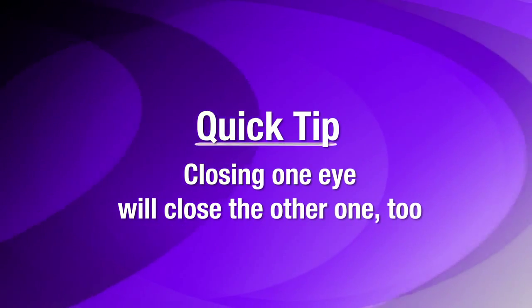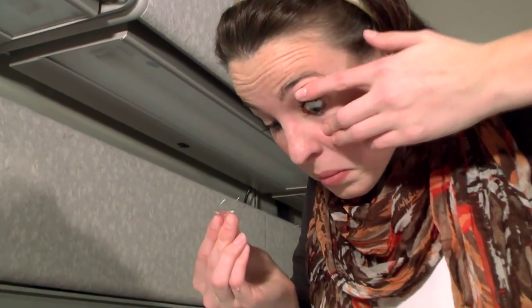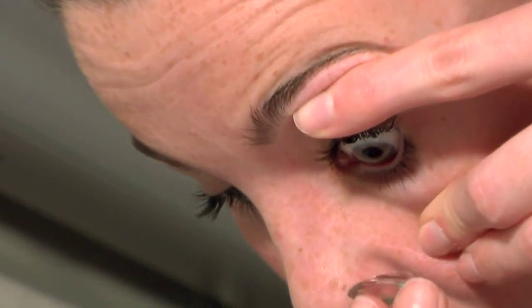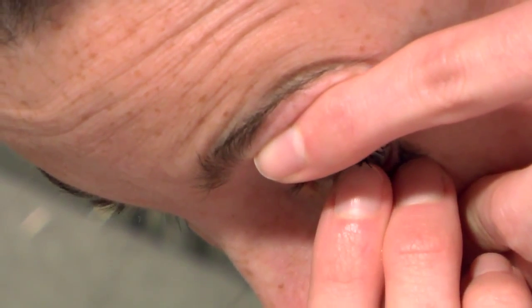Try keeping both eyes open as you apply your lenses. When you close one eye, the other will want to close too, and keeping both open may also help you to position the lens correctly. Lid control is essential. Make sure the lids are dry and use one hand to hold the lids completely out of the way. Don't release the lids until the lens is fully in place and the fingers or plunger have been removed.